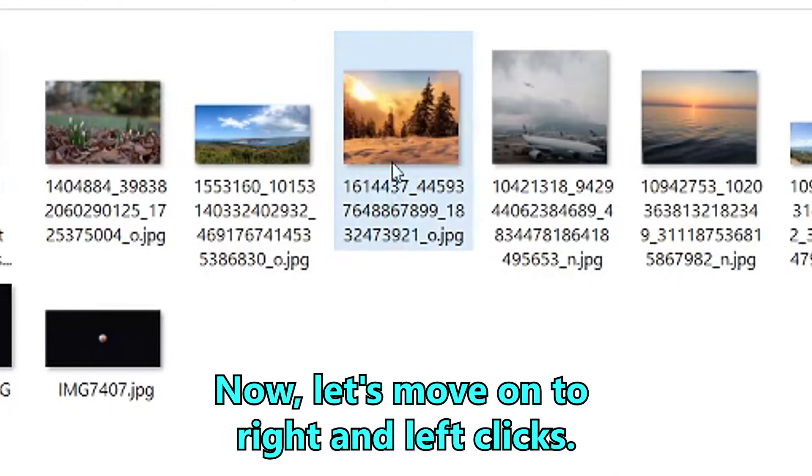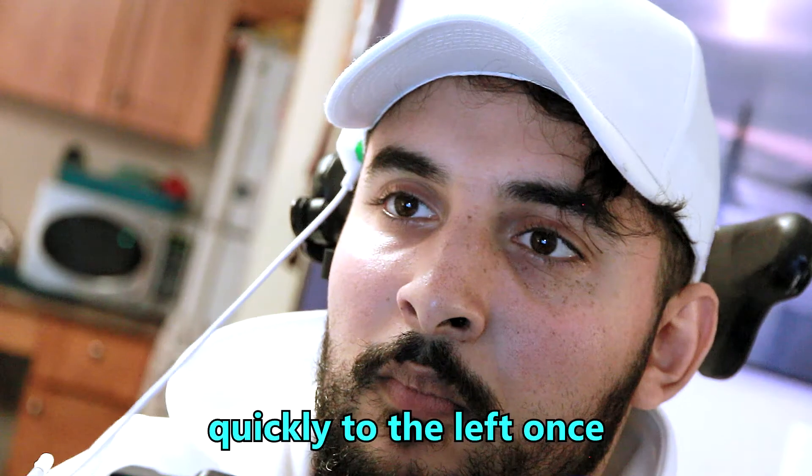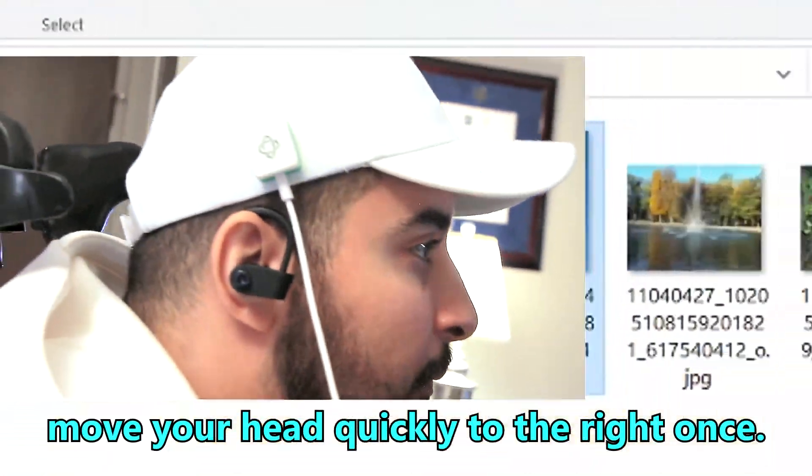Now, let's move on to right and left clicks. To do a left click, move your head quickly to the left once. To do a right click, move your head quickly to the right once.